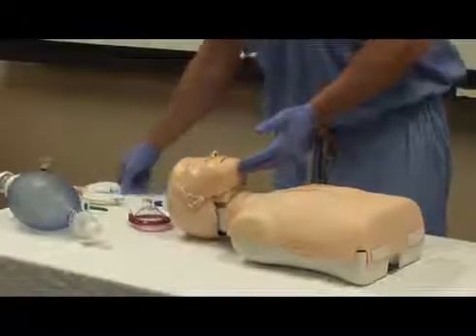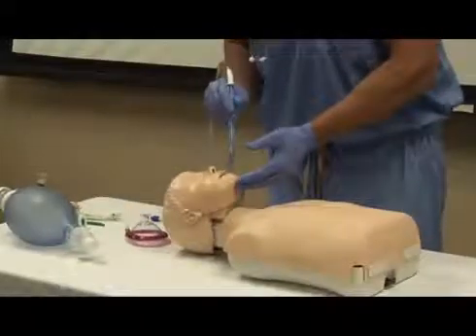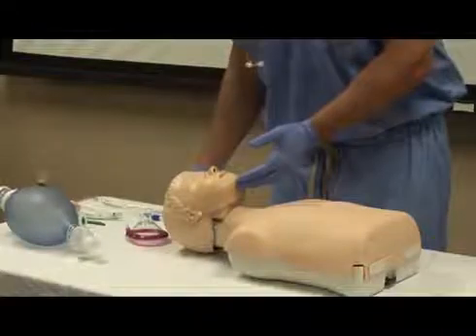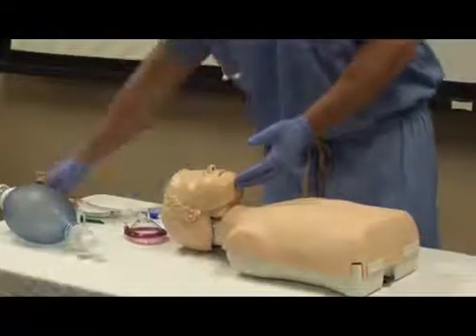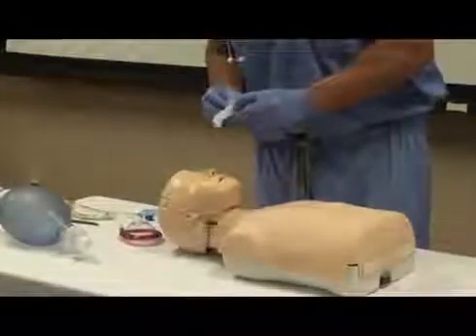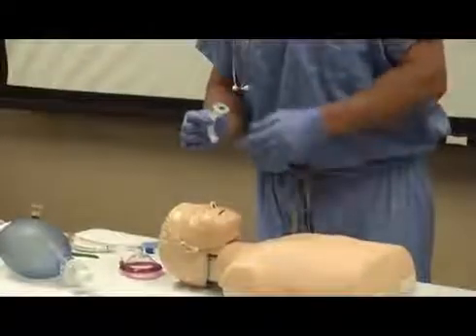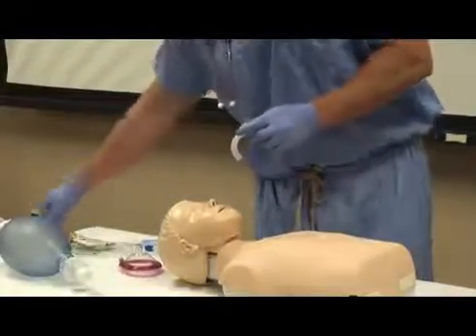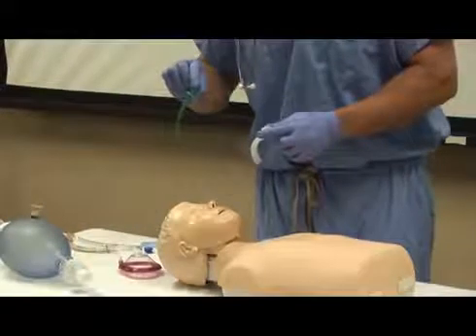Second, clear the airway. Suctioning may be necessary to remove foreign material or secretions. Now that the airway is open and clear, consider a couple of airway adjuncts to maintain patency. There are two main types: the oral pharyngeal airway for an unconscious patient, and the nasal pharyngeal airway for conscious patients.